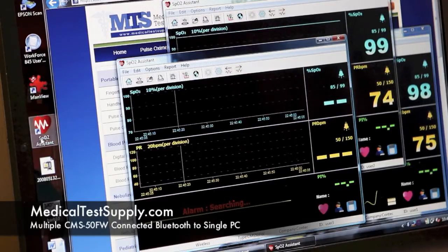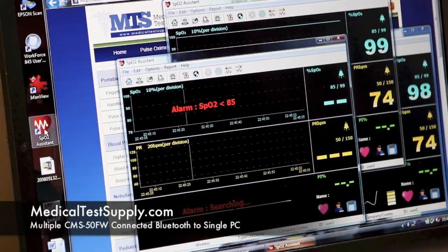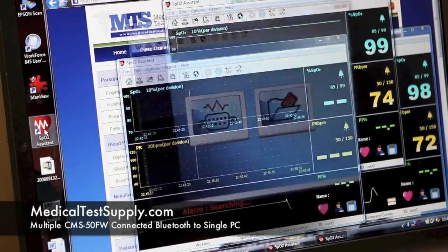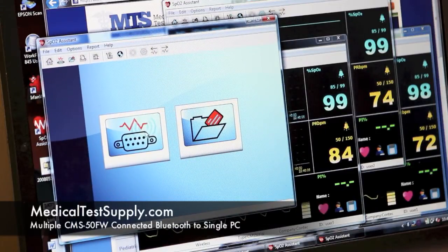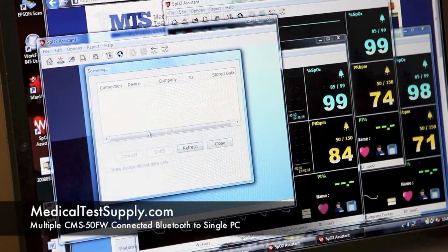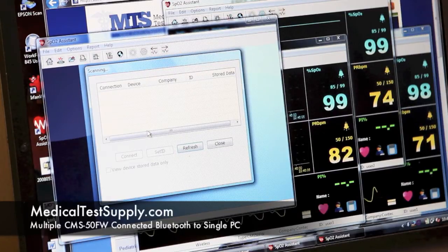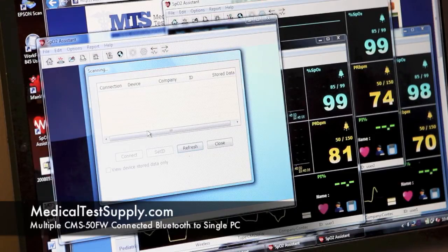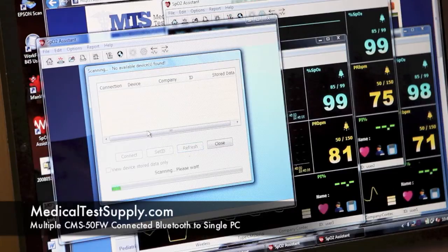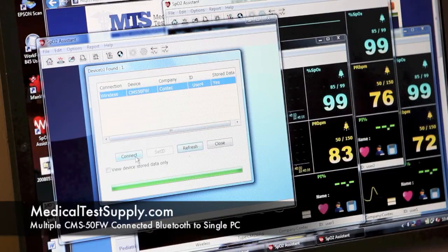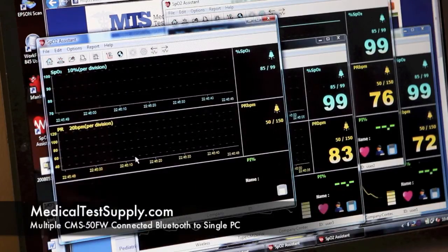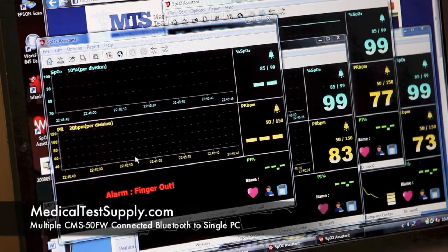Go ahead and start our fourth instance of SP02 Assistant. Move the window so we can see it working. Now we've found user 4 — we'll just connect to that. We can see the finger out.